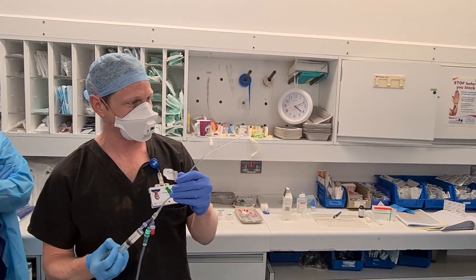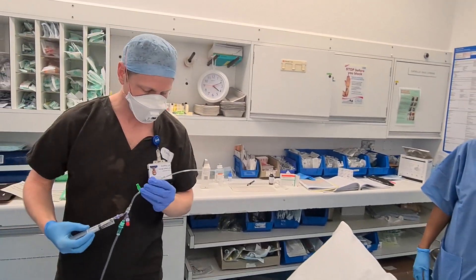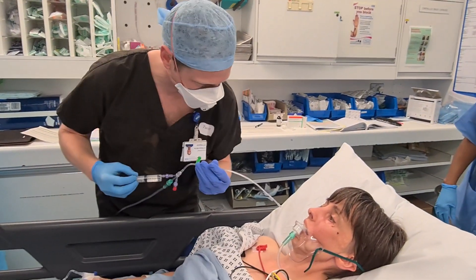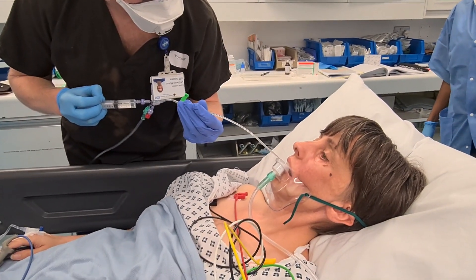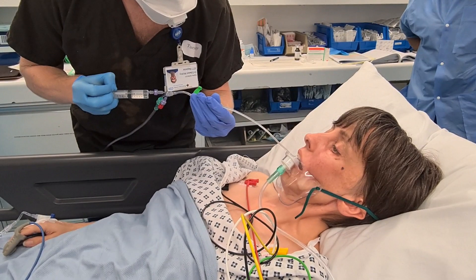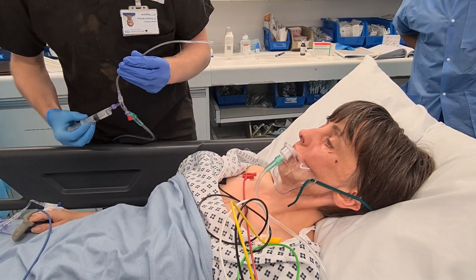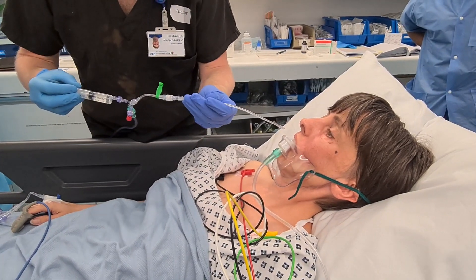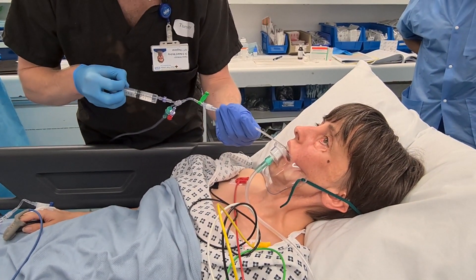I'm just going to show you something — this is the spray we're going to be aiming for. So that's the spray. I'm going to do the front of the mouth first. Just going to spray a little bit at the front. Take some nice big deep breaths — all the way in and all the way out. I think I'm going to give you a little bit of a break. Open your mouth all the way up. And it's going to go to the back of your throat. So deep breaths.